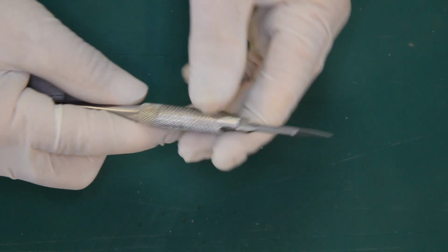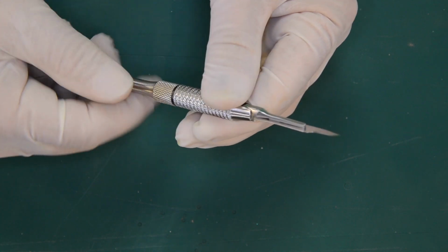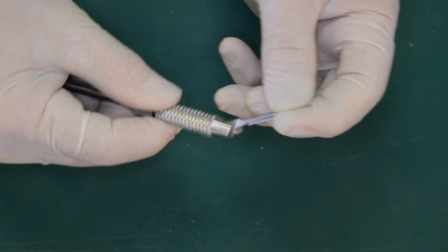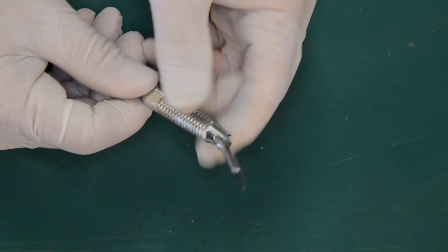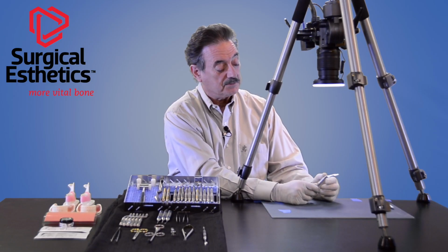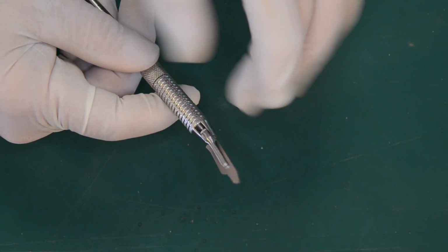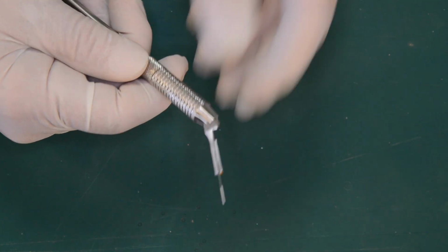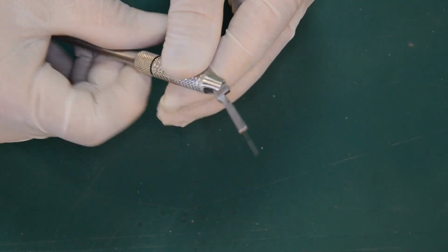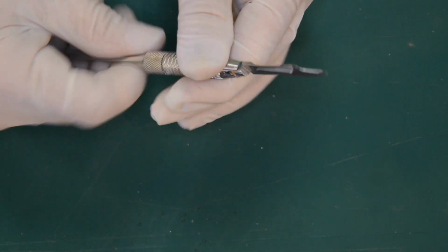This particular blade holder can also be adjusted to go at angles. So you can unscrew the back of it and move the tip and go at various angles. That's really helpful a lot of times, especially if you're in the posterior maxilla and you're using a 12 blade and being able to go in at a particular angle, pulling forward, this really helps. So again, this is our kind of workhorse blade holder.